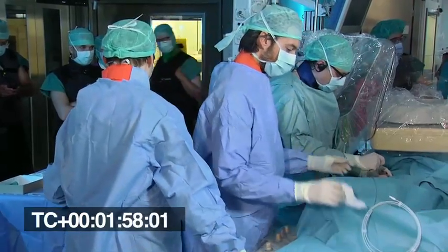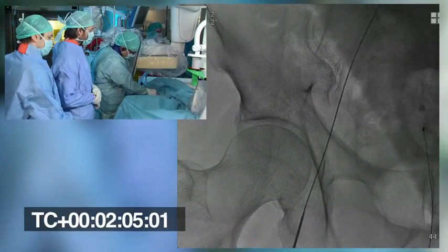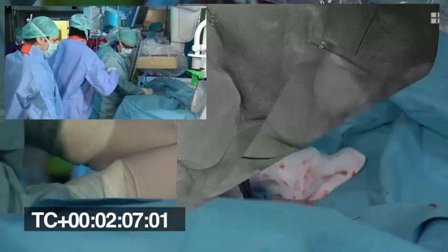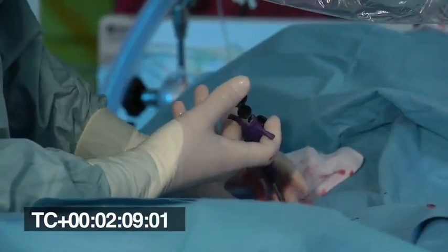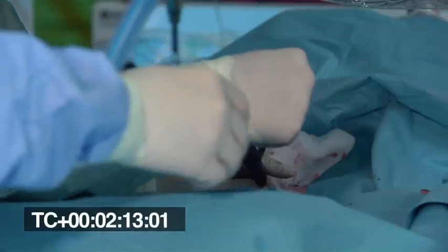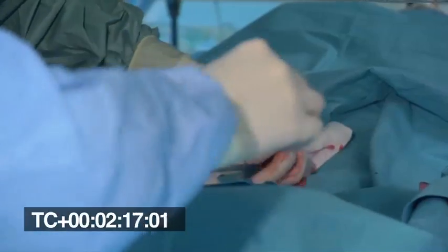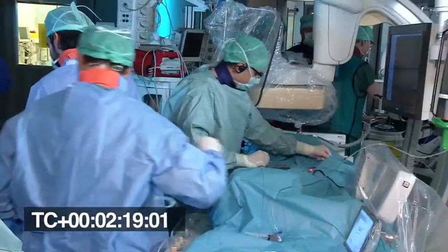As standard practice for Cardioband, we start with two accesses: one is a venous access in the groin — femoral vein — and there will also be arterial access. This step will be pre-closure with ProGlide. Pre-closure in the venous side is a little bit tricky because you don't really see the backflow, but if you do it slowly you can see it.